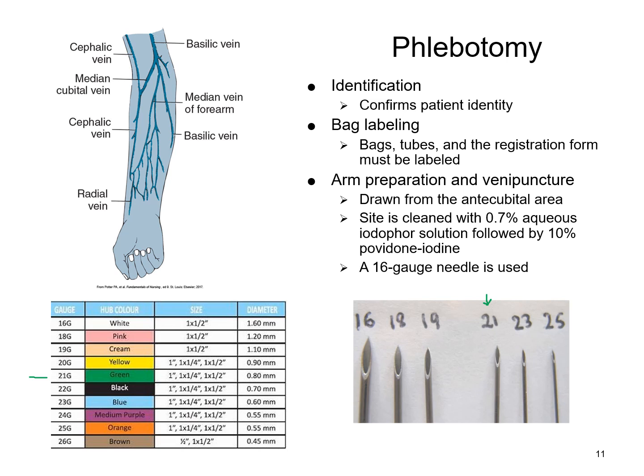If you're going to do a butterfly stick, those gauges are usually about 23. That lighter blue color would be a butterfly stick. So your donor needle is that 16 gauge needle, a really big needle compared to the typical 21 or 23 gauge needle.